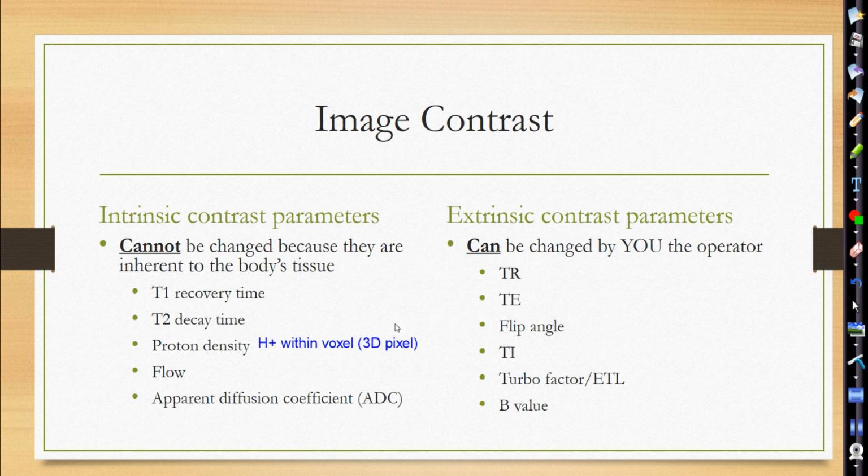I'm sorry, what was flow again? Flow, just blood flow. Oh. Blood flow. Or CSF flow. So I'll just type it down here. Let's say blood or CSF. Because we actually try and visualize CSF and blood flow for certain pathologies.